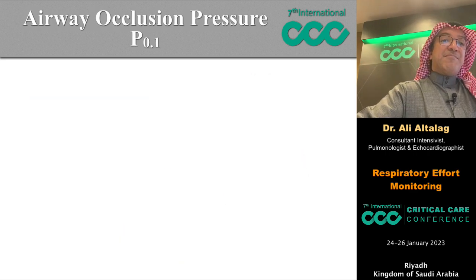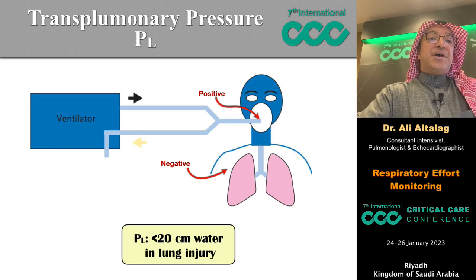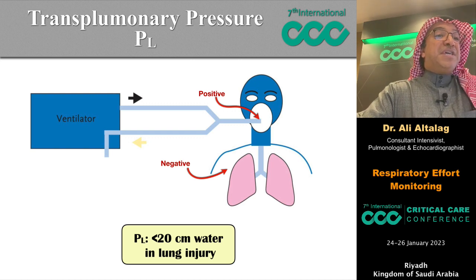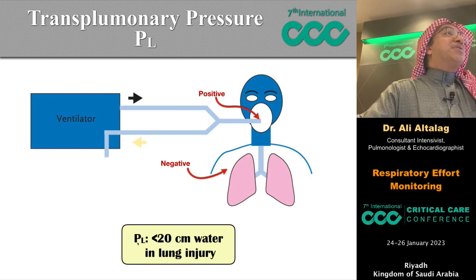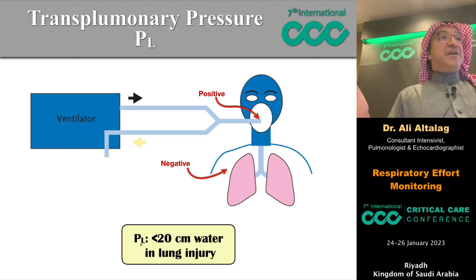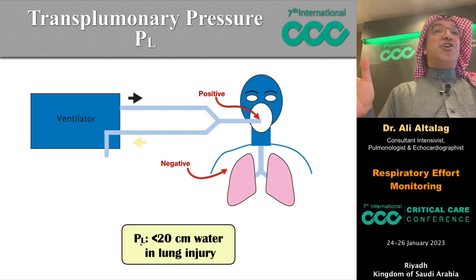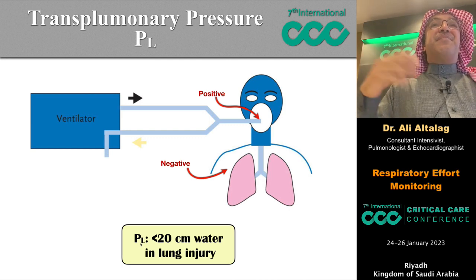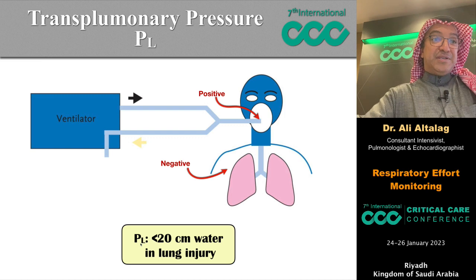I wanted to say something also here, which is the fact that not only the peak transpulmonary pressure is important, the transpulmonary pressure is a dynamic pressure, and pendelluft plays a major role. Although we use the peak transpulmonary pressure as a measure, there are many factors that play in this particular situation.